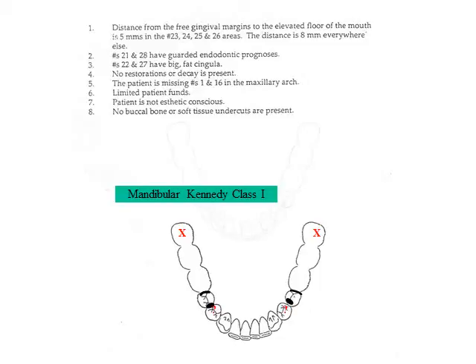The rest seat placement calls for a tripodal or quadrant support form. The primary abutments will use a mesial rest, whereas secondary abutments are best placed on the cuspids. This will allow the partial denture to maintain vertical stability in the event that the questionable first bicuspids are lost. Placement of the rest seats defines the fulcrum line.